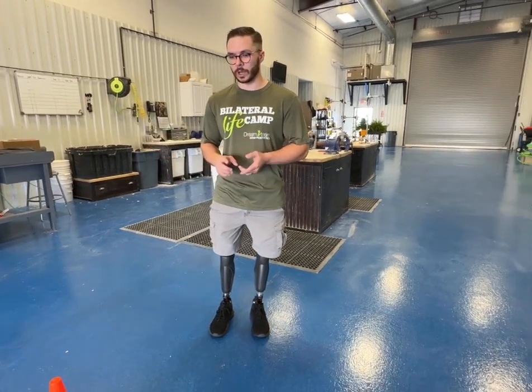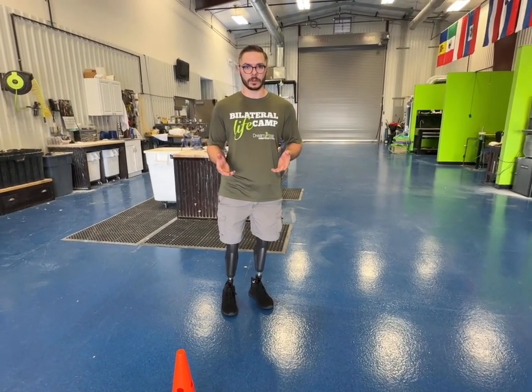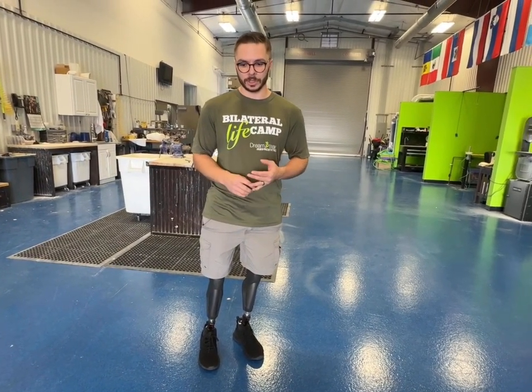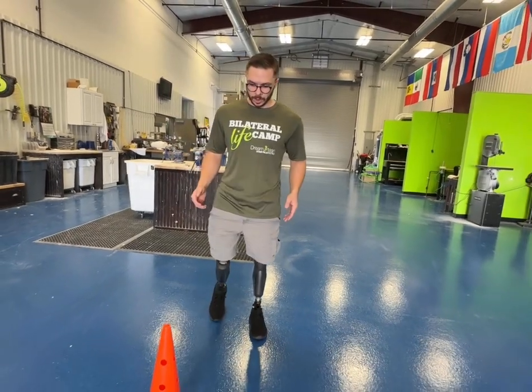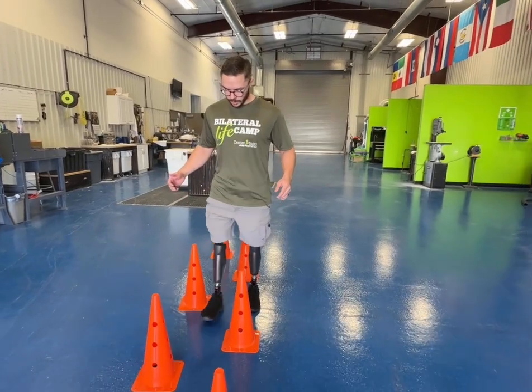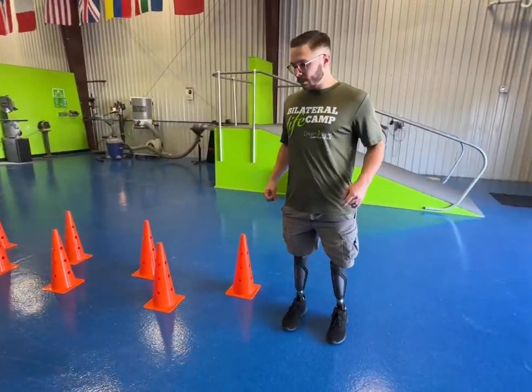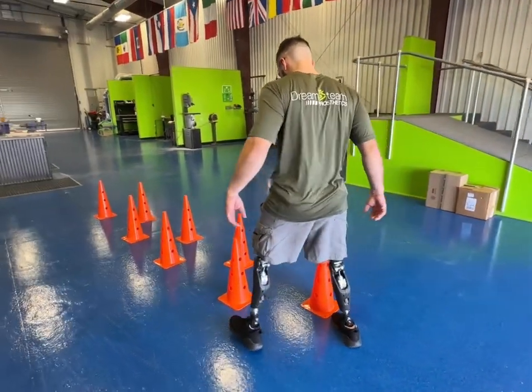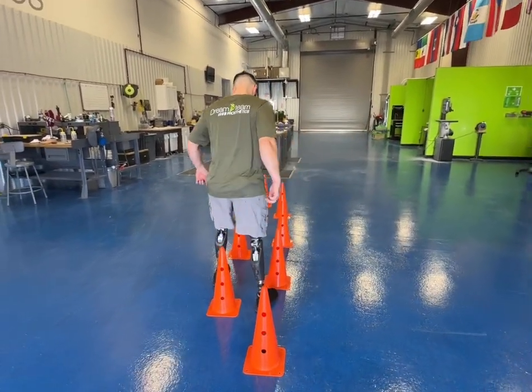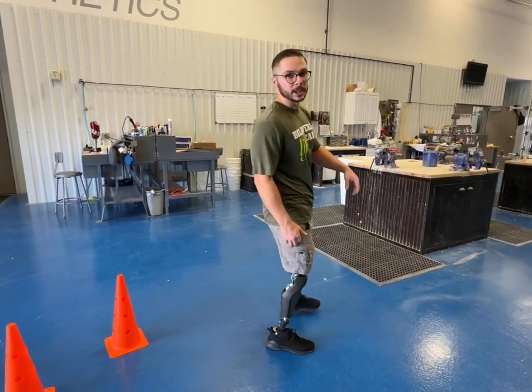A narrow base is more energy efficient and more natural when you're walking. The whole idea of having prosthetics is to get back to as normal of ambulation as you can. Here we're going to demonstrate why it's so beneficial — you're able to navigate smaller areas more efficiently. With your legs really far apart they can be rather cumbersome, but walking through with a narrow base you're still able to bend the knees and maneuver the cones without too much difficulty.